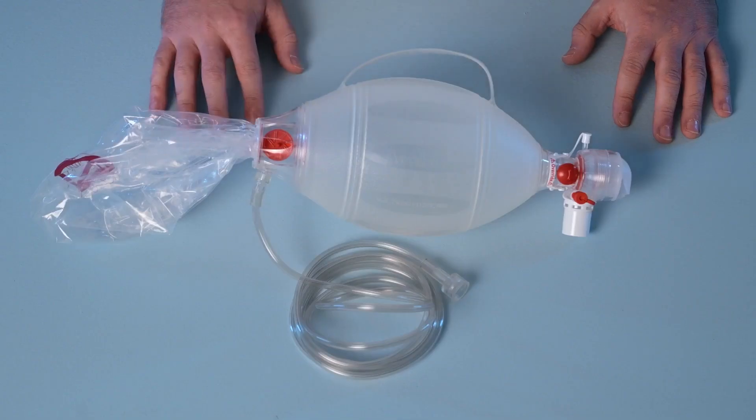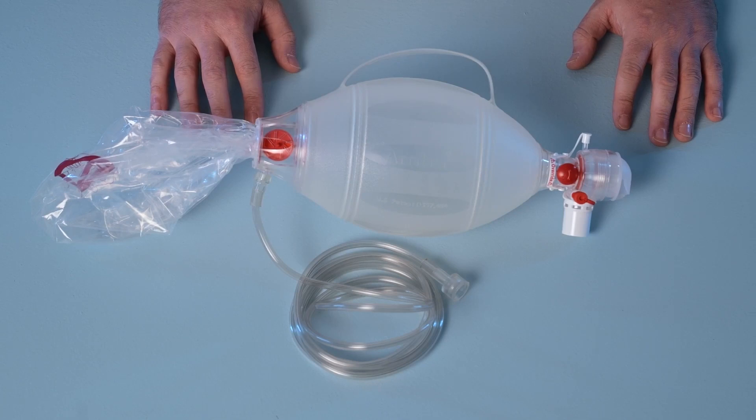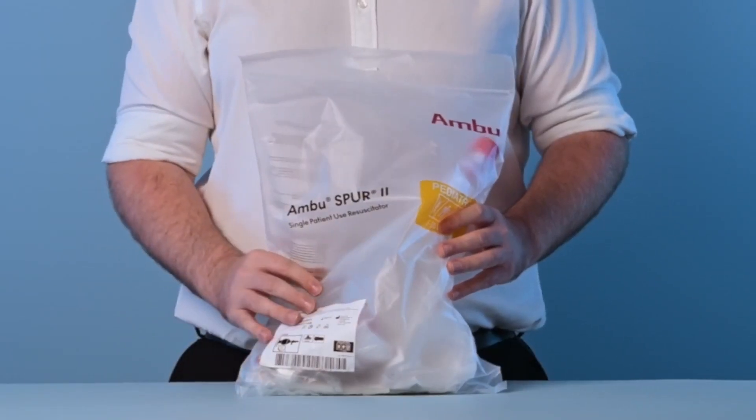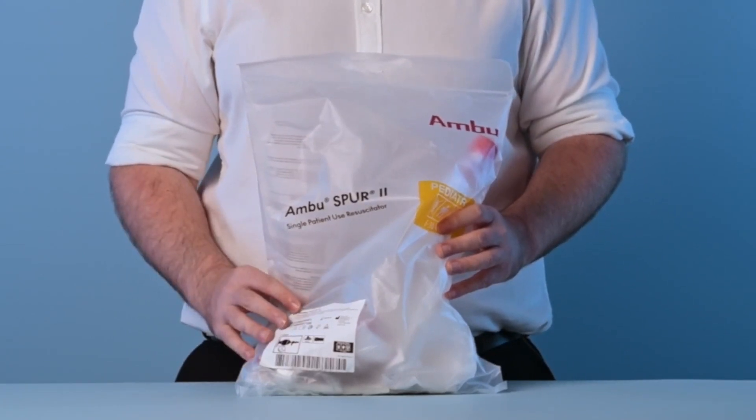The infant size Spur2 is also available with a reservoir tube instead of a reservoir bag. All Spur2 devices are MR conditional, they're supplied non-sterile, and each comes packaged in a colour-coded plastic pouch that features a handle for transportation.